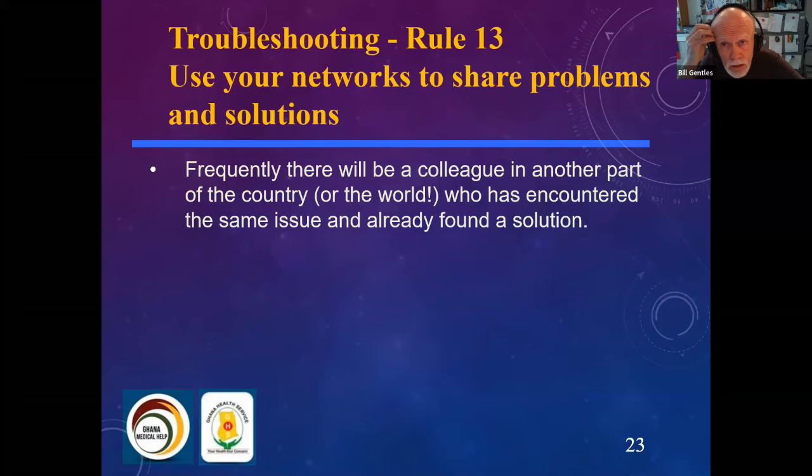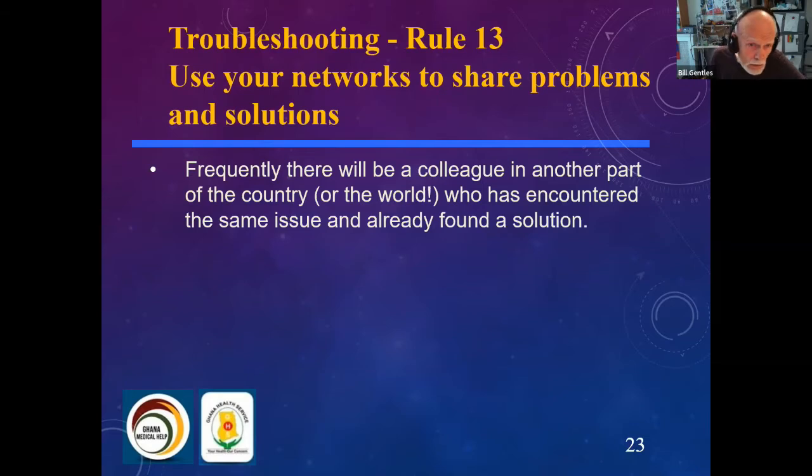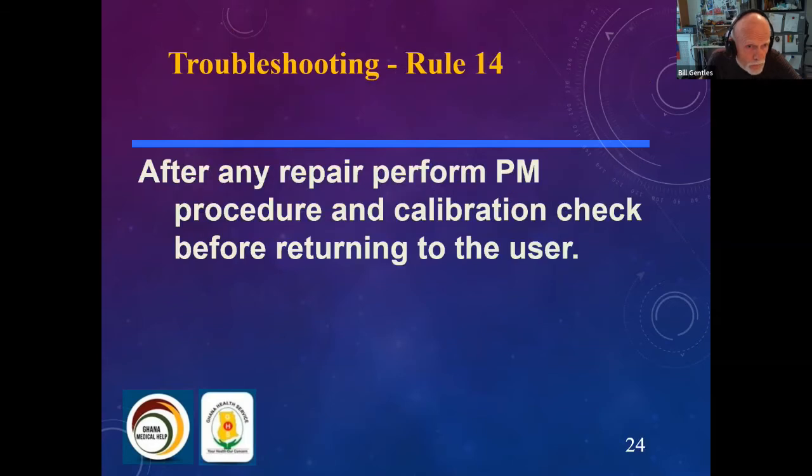Available at a local electronic supply shop for about $2 or 10 Ghana cedis. He replaced that capacitor on probably 4 or 5 of these power supplies and saved our hospital thousands and thousands of dollars, simply by connecting with a colleague in another part of the country with our problem, and he provided us with a solution. So I strongly encourage you to use your available networks to share your problems with others, because many heads are better than one in solving these problems.